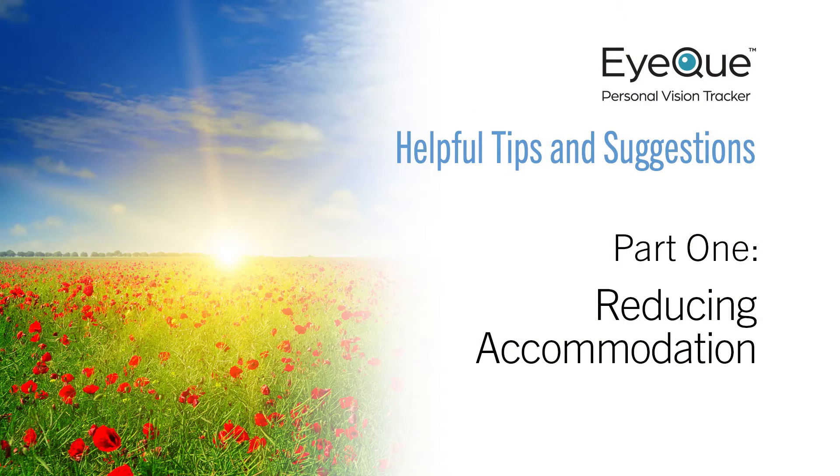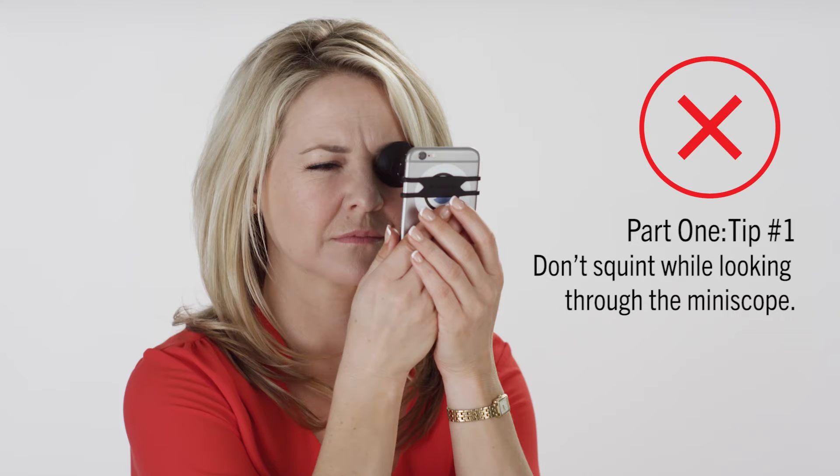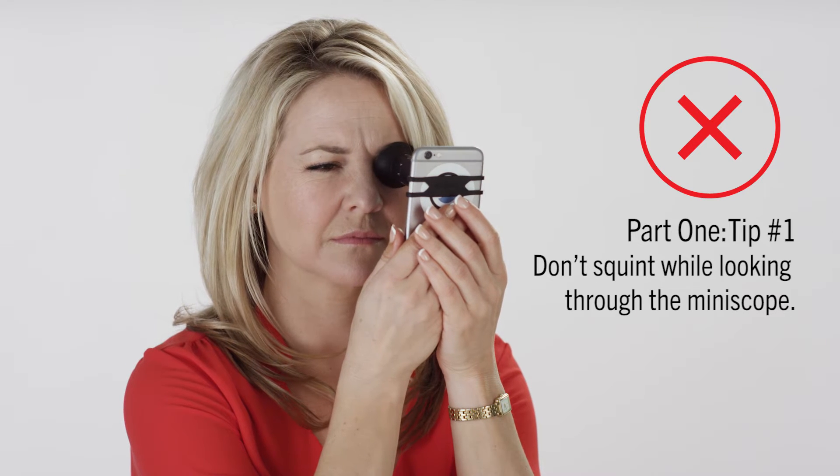When you're getting ready to start a new vision test, keep these helpful tips in mind. While viewing the test screen through the Miniscope, it's important not to squint. When you squint, you force your eyes to focus on a close target. Instead, try relaxing your eyes and look forward.